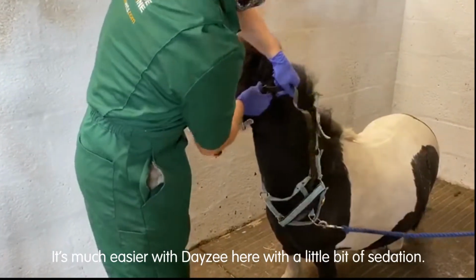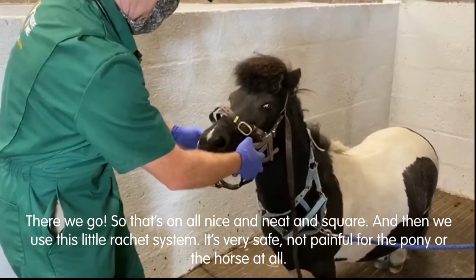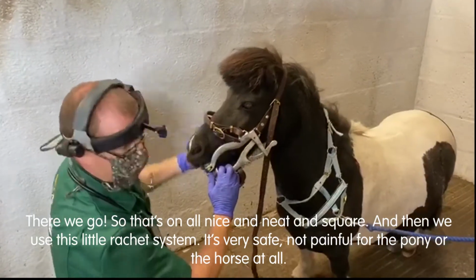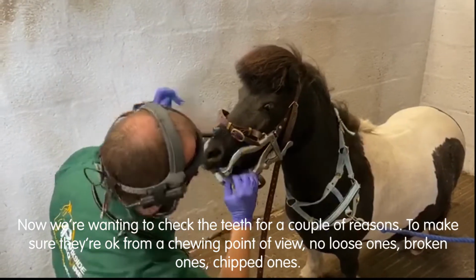Much easier, like we've got with Daisy here, with a little bit of sedation. There we go. So that's on nice and neat and square. And then we just use this little clever ratchet system that's very safe, not painful for the pony or the horse at all. And so we can have a good look.